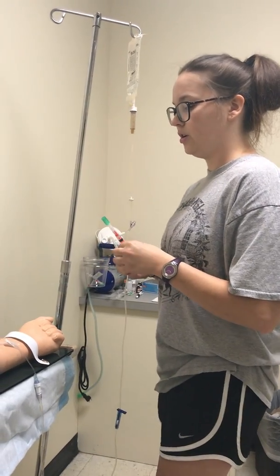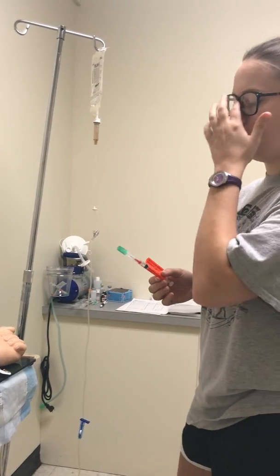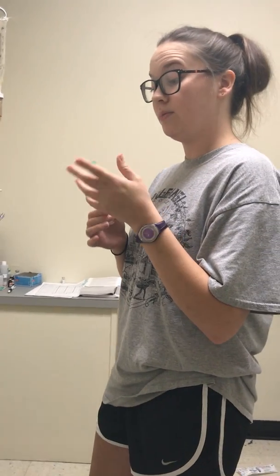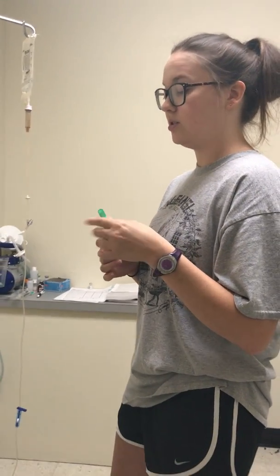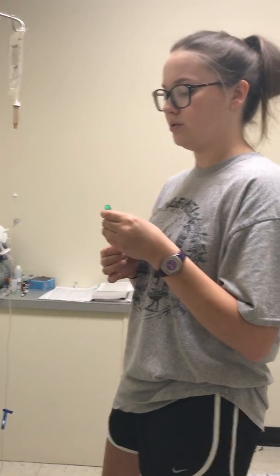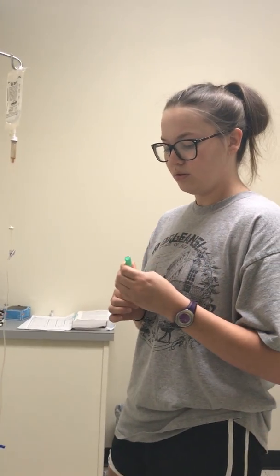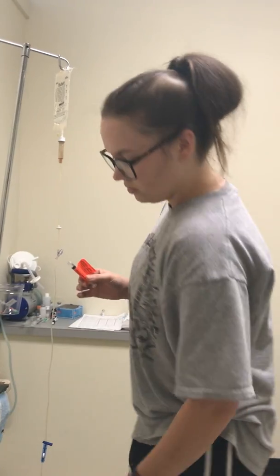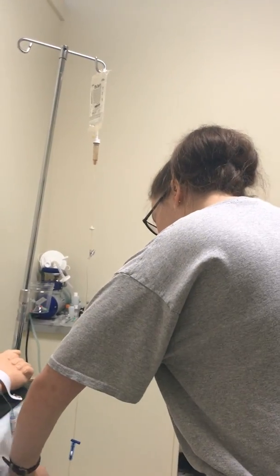My solution, and also before giving the medication, I would let the patient know if he needs to stand up for any reason after it's given, or if he feels any unusual pain in his arm, to just let me know, and not try to get up by himself because it causes sedation and he could fall, so it's a safety risk. I'm going to take my needle off, grab the hub without touching it.